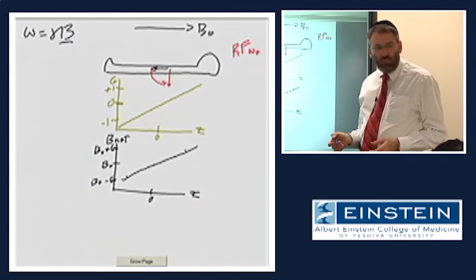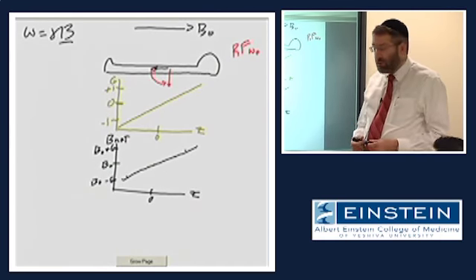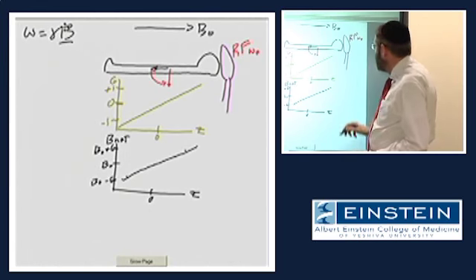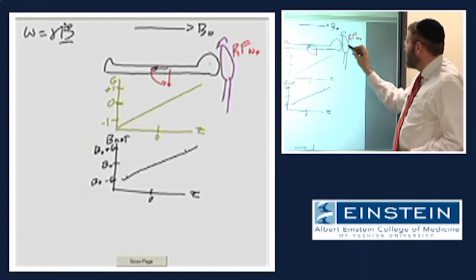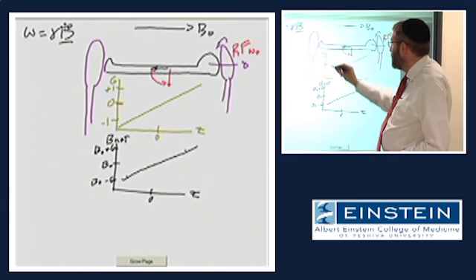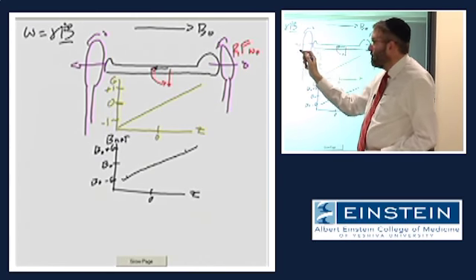Because at this point I'm just reviewing the nature of this gradient magnetic field and what it does. What creates it? Two electromagnets, one at each end. Basically, to be simple, a coil of wire with some current running through it that generates a magnetic field that looks like that. And another one over here, a coil with current going in the opposite direction, generates a magnetic field that looks like that.